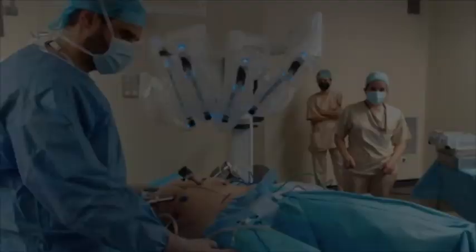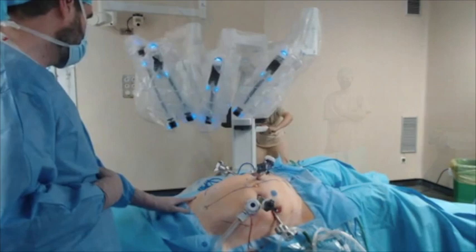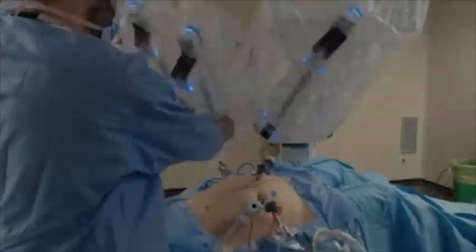At this point, a second docking manoeuvre takes place. The operating table is moved 180 degrees to allow the robotic platform to be docked 45 degrees to the left inferior part of the patient. For this new docking manoeuvre, the arms have been loaded as follows: Arm 4 tip-up, Arm 1 bipolar, Arm 2 camera, and Arm 3 monopolar.